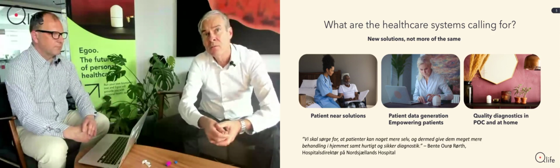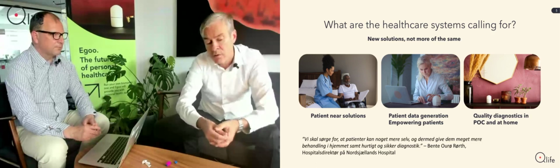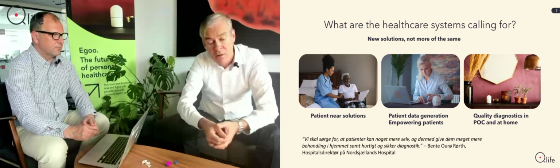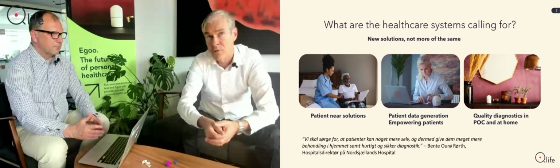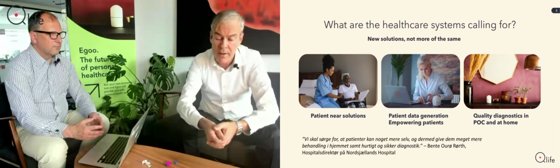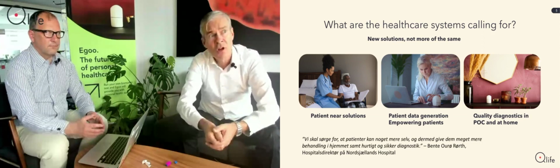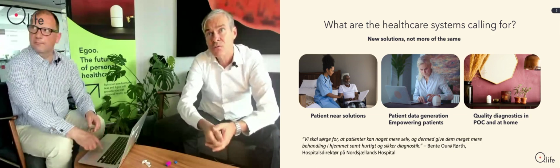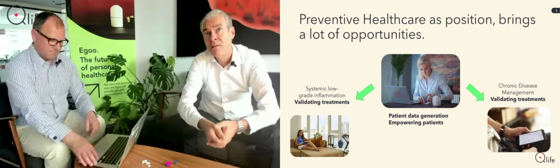The next one is the one that we're talking about today, is really the private clinics, where people that are either diagnosed or non-diagnosed, it could be both, are going to talk to a dietitian or a physiotherapist and get some health interventions. And here, what we would like is that the health practitioner is using our system to basically validate what they are doing.